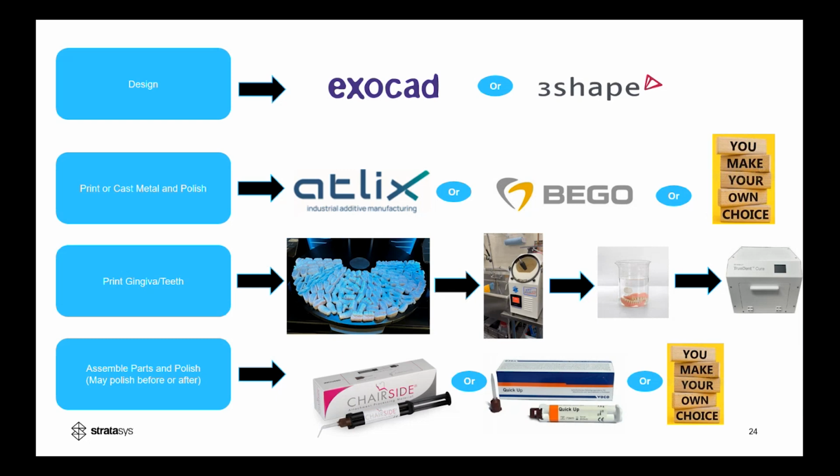Adrian, I'll just add one thing on the tooth thickness. If somebody's applying that tooth thickness, the chipping is more of a function of disclusion. So you need to create disclusion in protrusive and excursive movements, and that's really a main factor in tooth chipping, and not the thickness. So it's very important to have a 1 to 1.5 millimeter horizontal and vertical overlap so you don't have any type of collision in protrusive movement, movements that will create chipping. So again, it's a factor of anterior guidance, not thickness. Thank you.